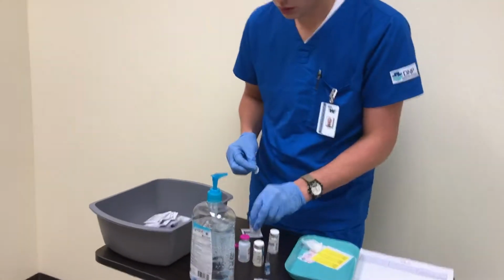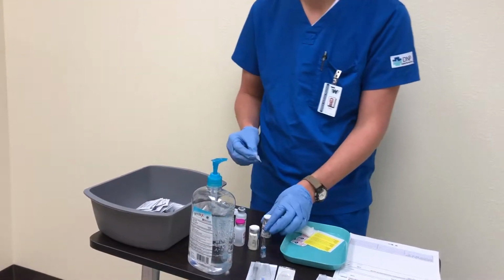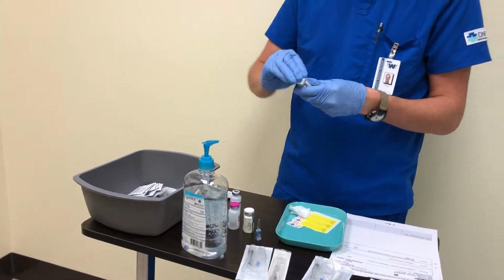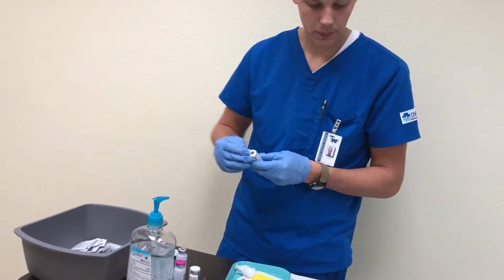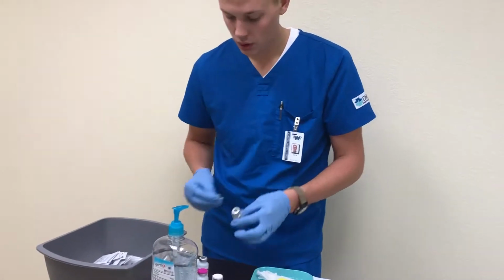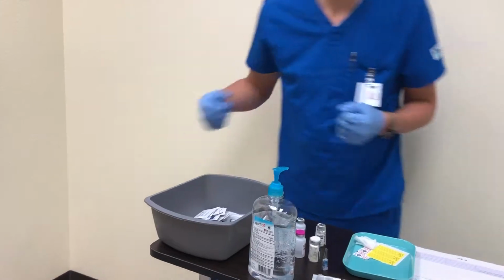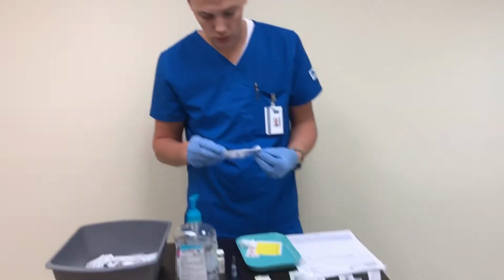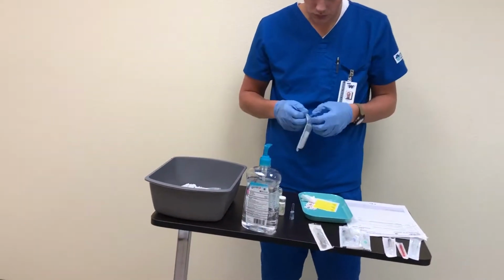Okay, so there's one, there's 2, and again that is my TB PPD. Okay, so that can go in the garbage. And then I'm going to pull out my 3 mil 23 gauge syringe and needle.